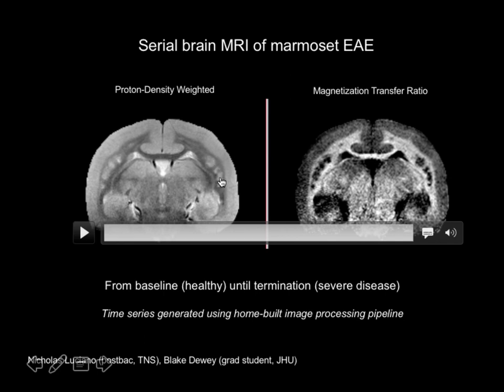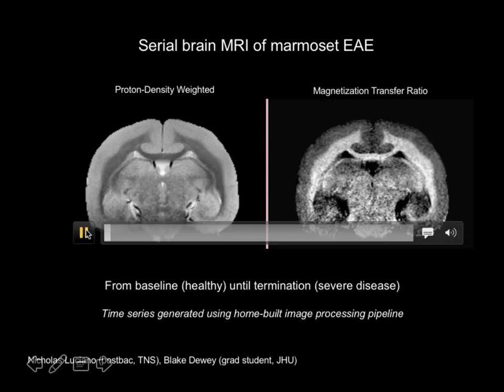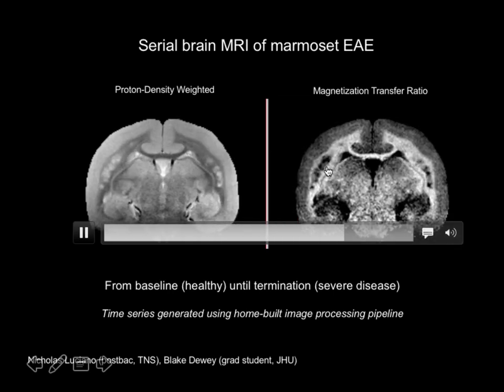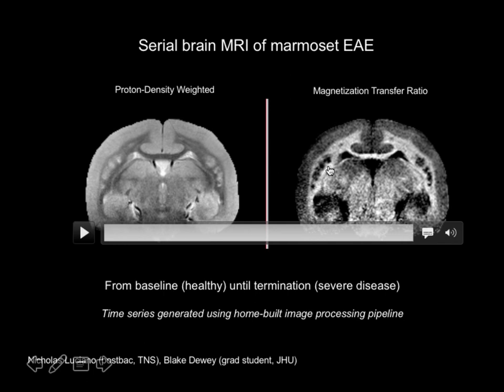We don't really know what's happening there besides the inflammation and probably demyelination. This is a more specific advanced technique called MTR, magnetization transfer ratio, that a lot of people in the field, especially in the pharma industry, believe is actually very sensitive to myelin. So if you want to develop a drug that promotes remyelination, this is the kind of imaging you're going to want in your clinical trials. So we actually tested it in our animals, and I'm going to play it again. Instead of being bright on this contrast, the lesion is going to be dark, and the level of darkness, which is here really, really dark, tells you there's probably heavy tissue damage happening here, probably very important demyelination.